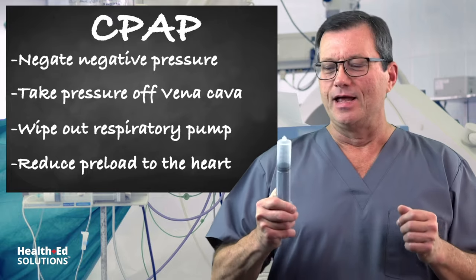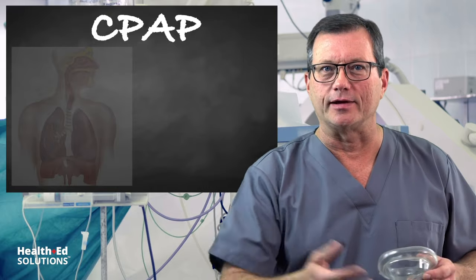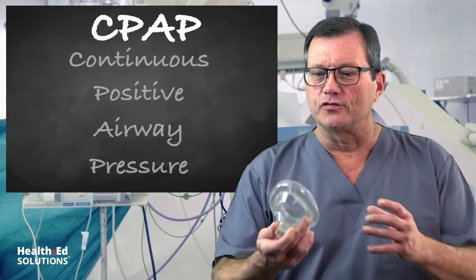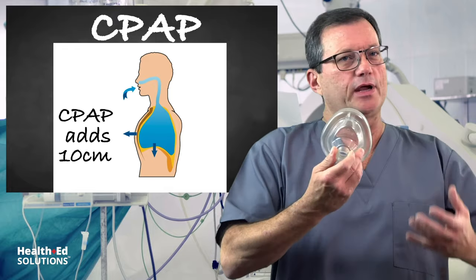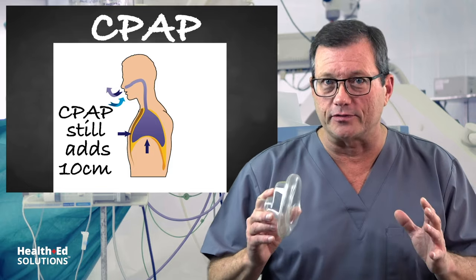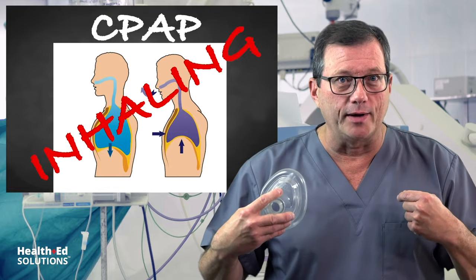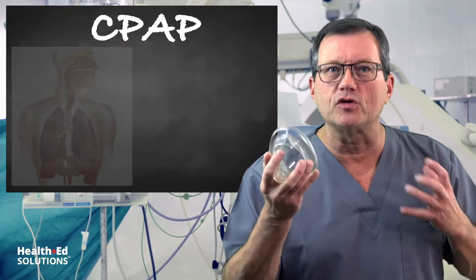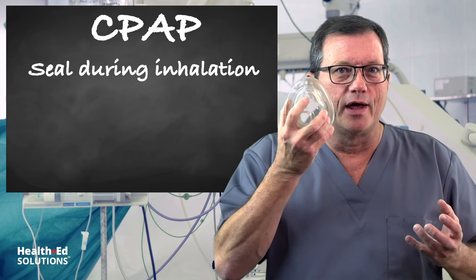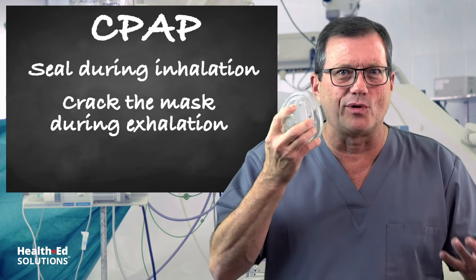When it comes to compliance with CPAP, it's not usually the inspiratory phase bothering the patient — it's the exhalation. CPAP at 10 centimeters of water pressure feels great on inhale, but the patient can't exhale against it. Here's a tip: give the patient control of the mask. Have them hold it on their face for a good seal during inhalation, but if they're having trouble exhaling against that pressure, have them crack the mask a little bit so they can exhale. As they get used to it, you'll get better compliance.